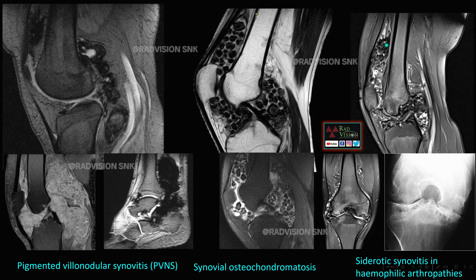Another case shows thick synovial proliferation with blooming on GRE due to hemosiderin deposition along with osteoarthritic changes and bony erosions. On radiograph, you can see broadening of the femoral condyles, flattening, and a deep intercondylar notch. This is a classical case of siderotic synovitis in hemophilic arthropathy.